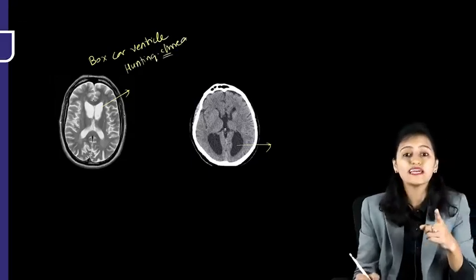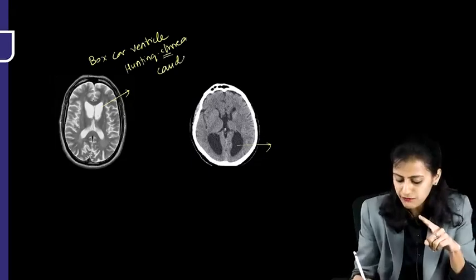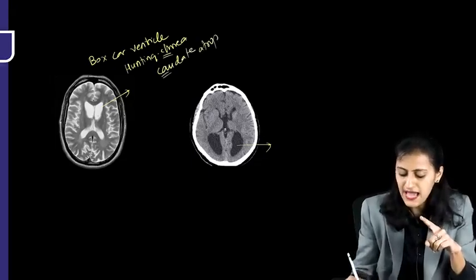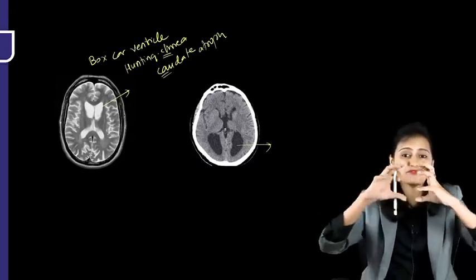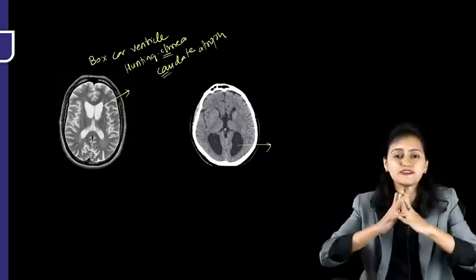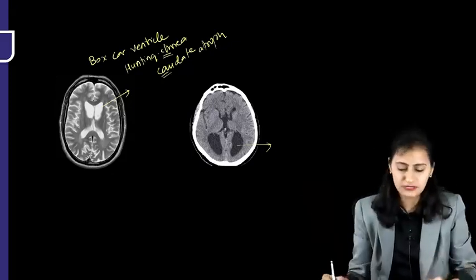right? Remember, chorea, C for C, is because of caudate atrophy, and caudate atrophy leads to the enlargement of the frontal horn. Adjacent to frontal horn is caudate. Caudate atrophies, frontal horn dilates, boxcar ventricle.